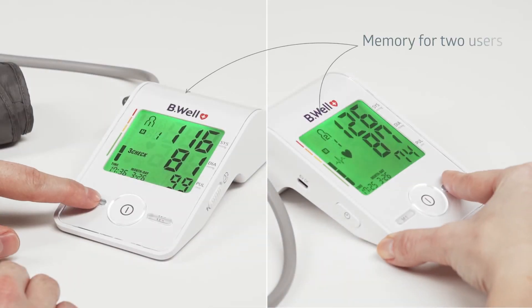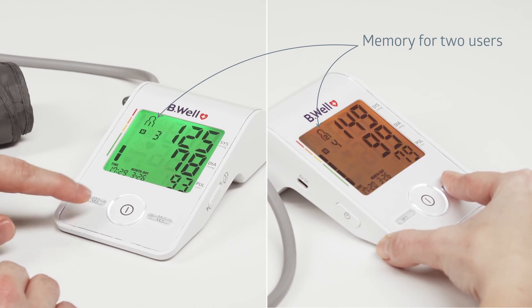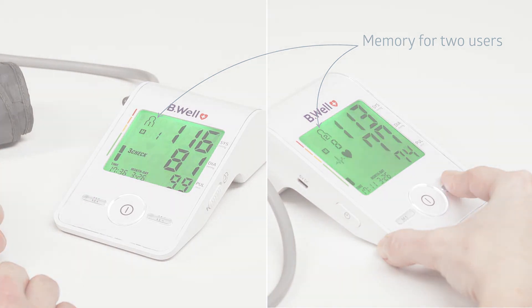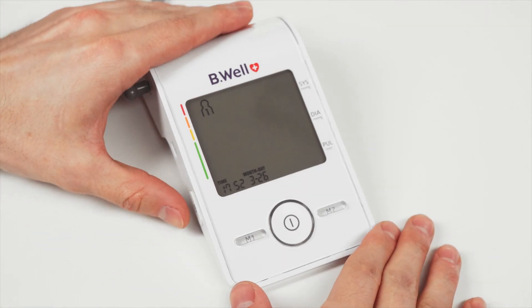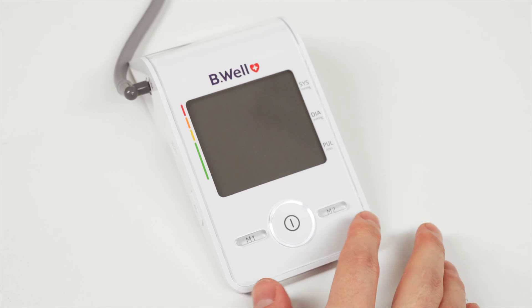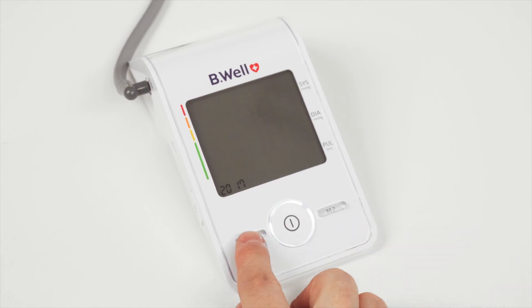The Med55 tonometer has a memory of 60 measurements for two users. To view and scroll through the memory readings, press the M1 or M2 button depending on the memory unit you need. The tonometer displays date and time for full blood pressure control. To set the date and time, press and hold the time button on the left side of the device for three seconds. The device will enter time setting mode, and the year, month, date, hours, and minutes must be set sequentially using the M1 and M2 buttons.